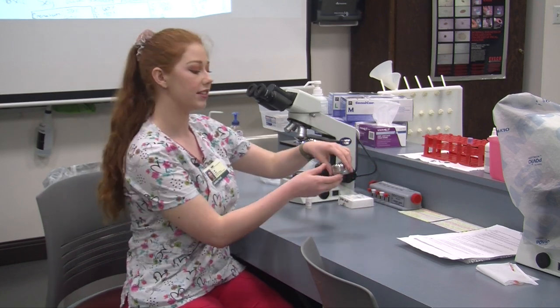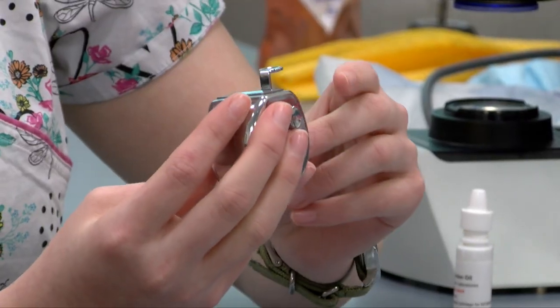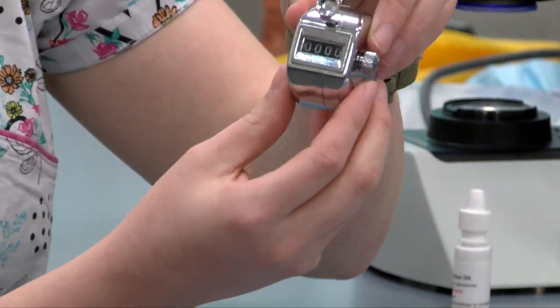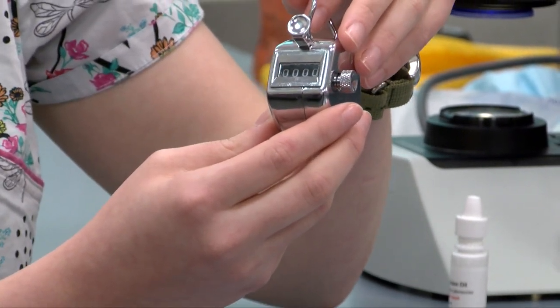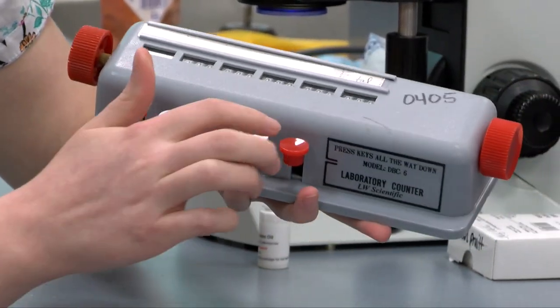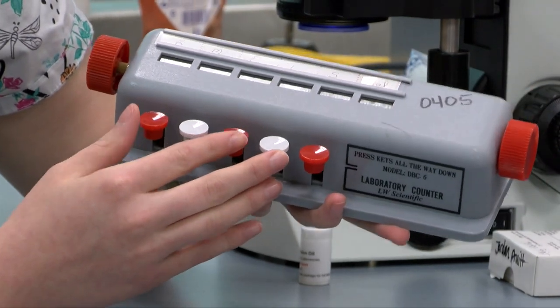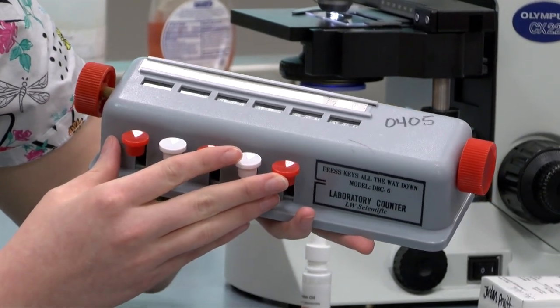These instruments are what we use to help us count blood cells and platelets. This instrument is our platelet counter — it helps us keep track of how many platelets we count. We count about 10 fields of platelets; however many there are at the end of our 10-field count tells us how many platelets were in 10 fields, and then we can average them per each field. This is our white blood cell counter; it has a spot for each type of white blood cell. I press down and it counts how many of each type I see, and at the end I can report how many I saw of each type, their absolute values and their percentages, as seen on our differential report.